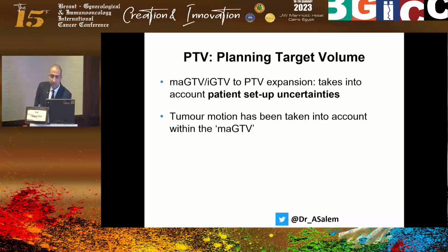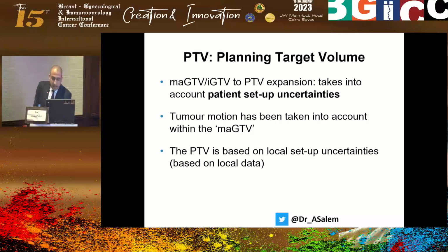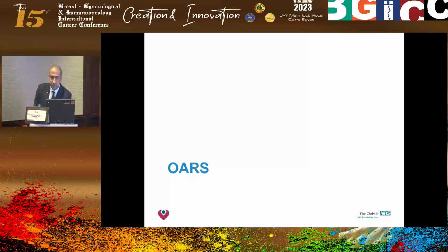And lastly, we will touch briefly upon the PTV. The PTV takes into account patient setup uncertainties. Bear in mind, you've already taken into account the motion of the tumor, so the internal target volume has already been done because you've done a 4D scan, or you've done something which is resource friendly within your setting, which potentially captures that motion of the tumor. This is obviously based on your local data. And while editing of the CTV, like we said, is allowed, editing of the PTV is not allowed.